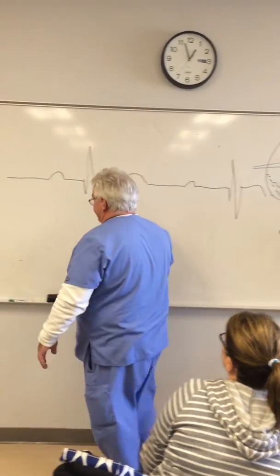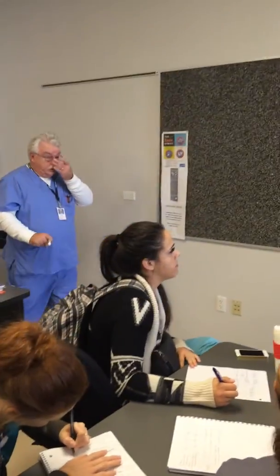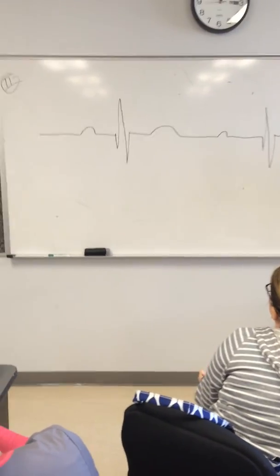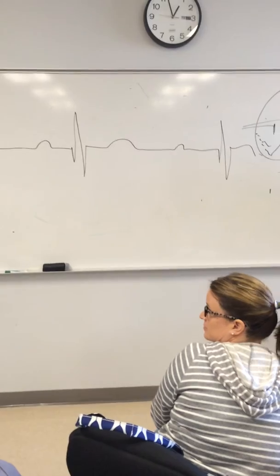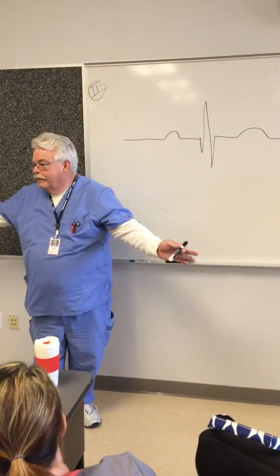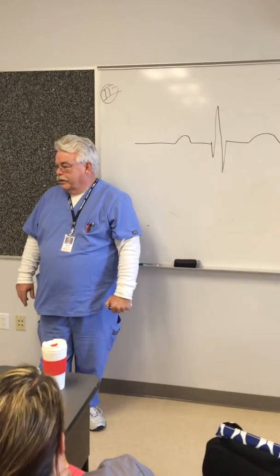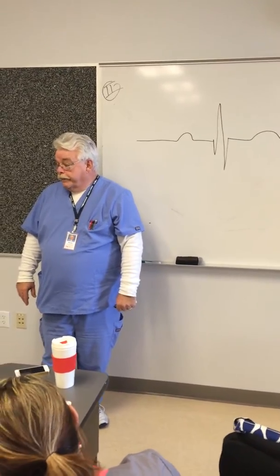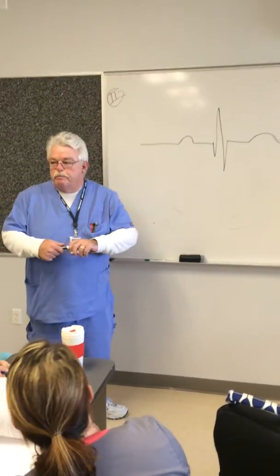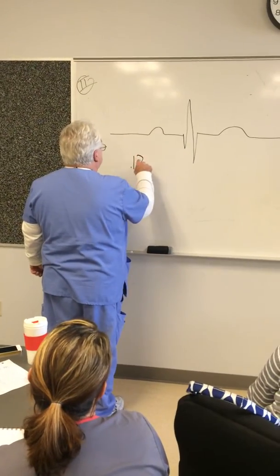All right, first question. Rhythm. Is it regular or irregular? Yes, it is regular. Second question, what's the rate? 70. Okay. Third question, is there a P wave? Yes. 3A, is there only one P wave? Yes. Okay, 3B. Is the PR interval the same?